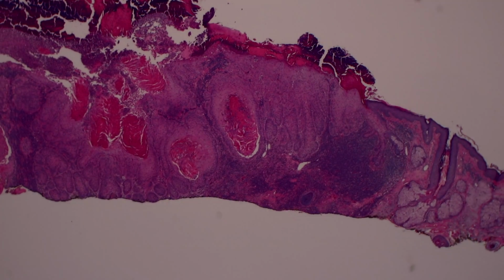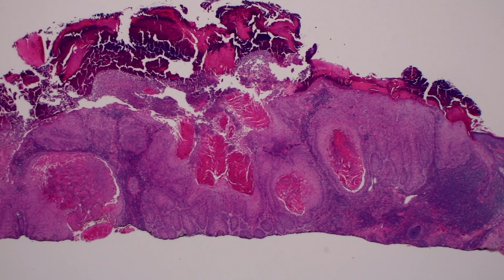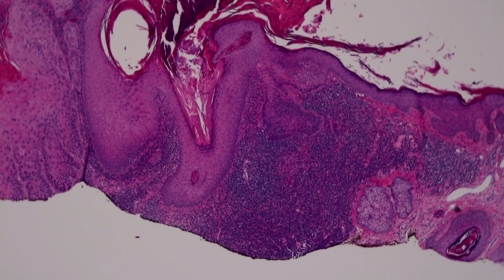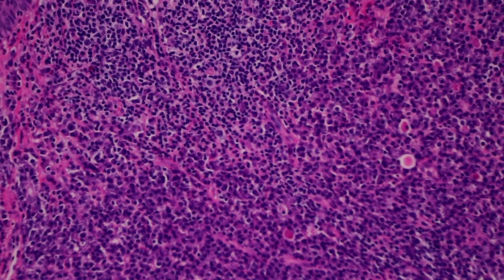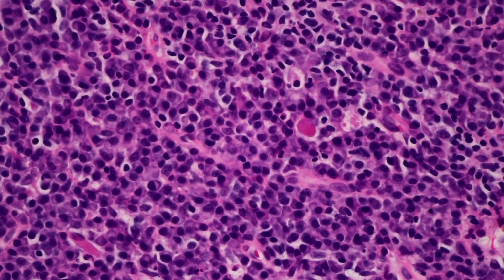So let's talk about a few other variations morphologically of squamous cell carcinoma. So here's a nice obvious squame, very nice and glassy, good invasion, nests of invasion down there. But look at all this dark blue stuff around it in the dermis. This is brisk inflammation, and not only of lymphocytes, but also many, many plasma cells. I think I mentioned earlier that plasma cells can just be florid. They can be numerous underneath squamous cell carcinomas and also underneath basal cell carcinomas. It's a little hard to get them to show up because of their color here. Let's see at high power if they show up. Yeah, there are tons of plasma cells here.